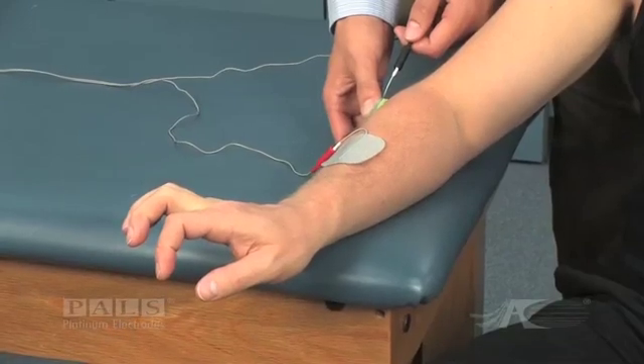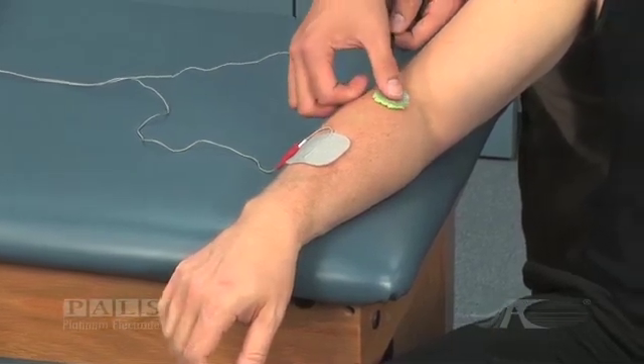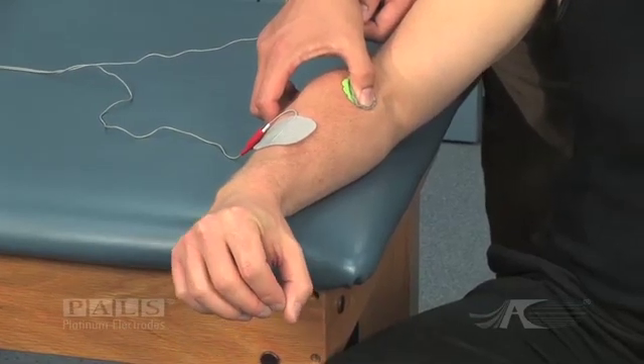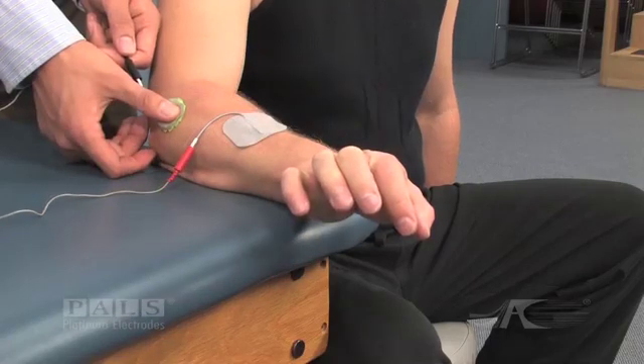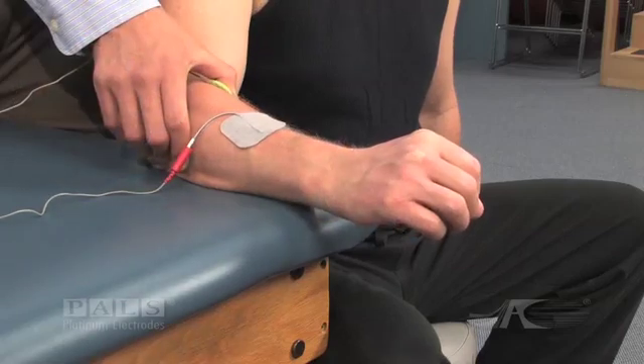Note in the video the effect of small changes in the electrode configuration and the resultant stimulation effect — moving from a balanced wrist extension to excessive ulnar deviation to excessive radial deviation.